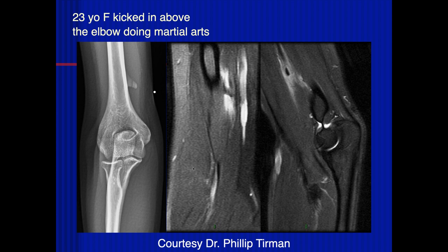There's the MR, right? And all I know is the avian spur can potentially cause some sort of impingement. I forget of what. But usually it's asymptomatic. Right. Now we can see there's edema around it here. There is that bone there.